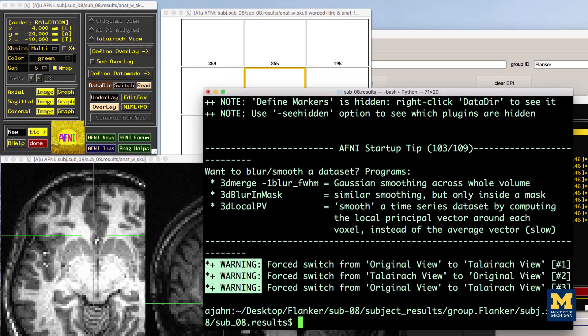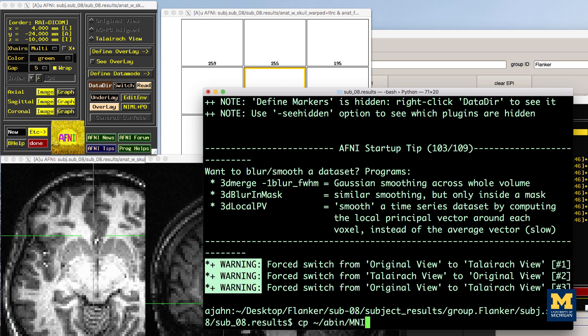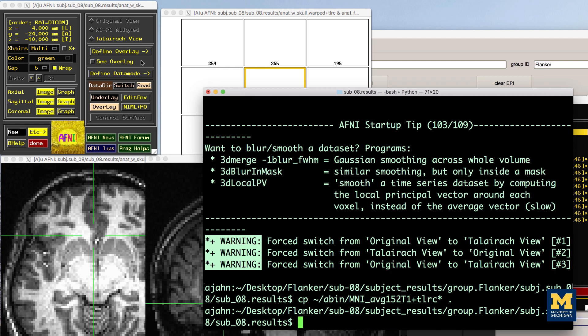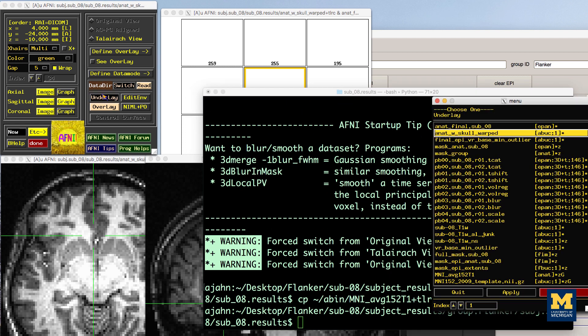If you have copied the MNI 152 image into a global directory, load it as an overlay image. You can also copy it into the current directory by typing from the terminal: cp ~/abin/MNI_avg_152_T1_*.